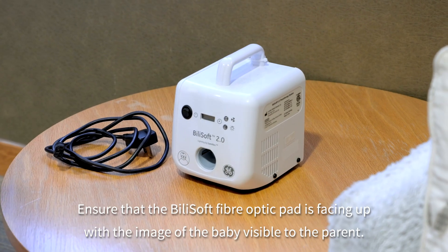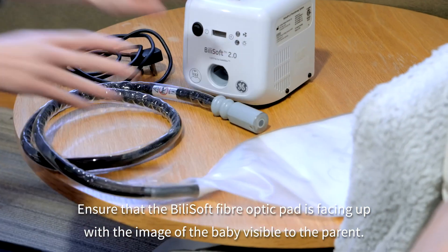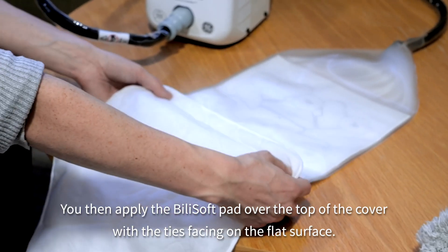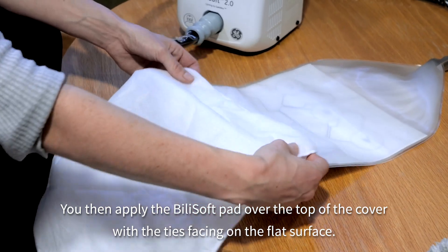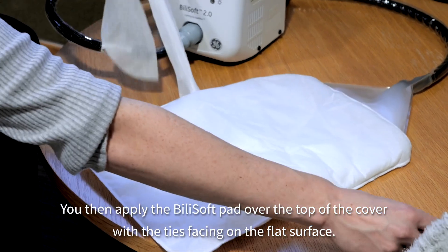Ensure that the Bilisoft fibre optic pad is facing up with the image of the baby visible to the parent. Then apply the Bilisoft pad over the top of the cover with the ties facing on the flat surface.